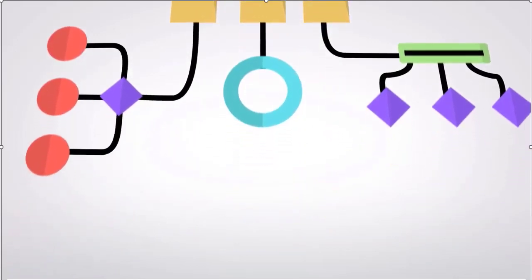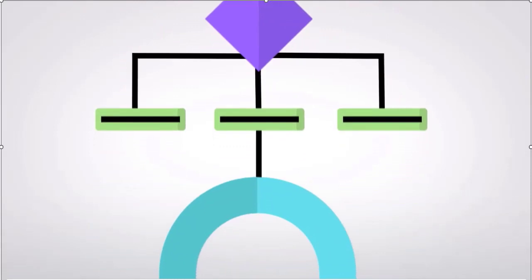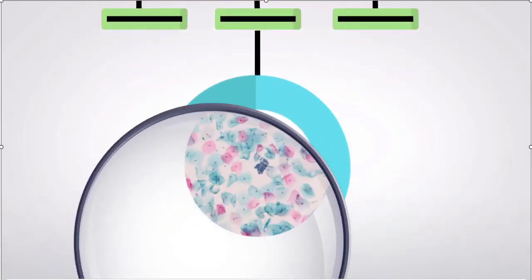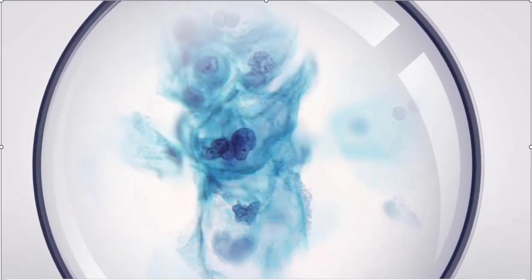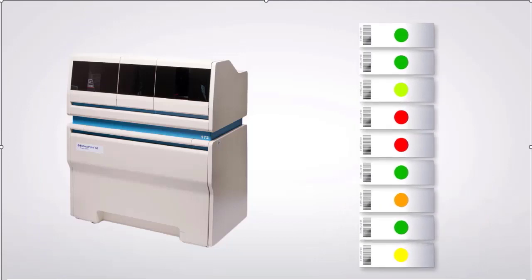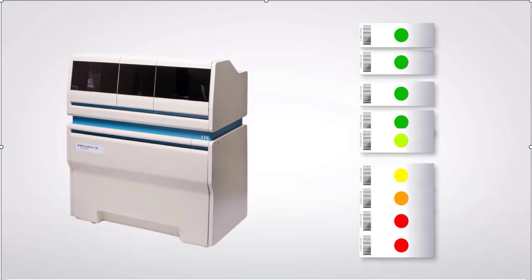Each object is segmented, analyzed, and classified as either an artifact, normal cell, or potentially abnormal cell, and prioritized fields of view are selected for closer inspection. Each slide is scored and ranked based on its probability of being abnormal.